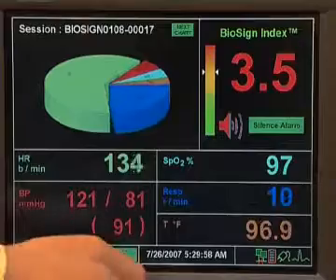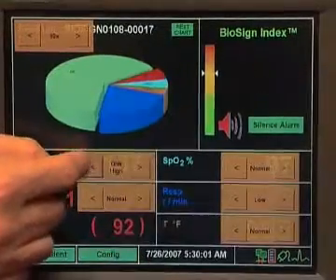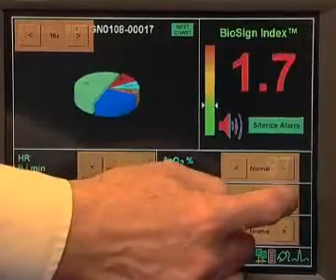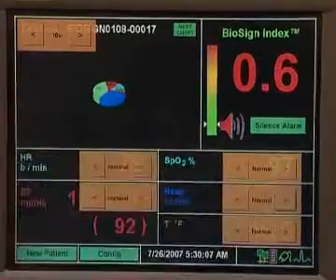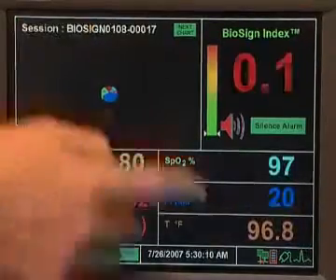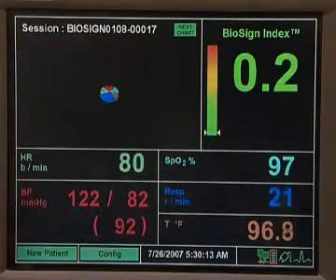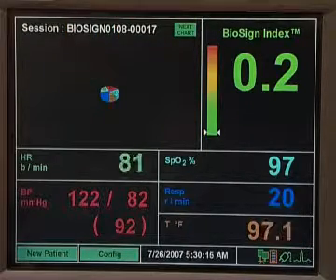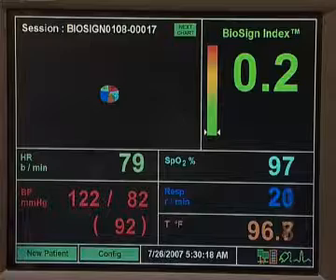Now let's imagine the patient recovers. I will restore these parameters to their normal values, and likewise for the respiratory rate. You will see that the number indicating abnormality goes right down — we're back in the green, the radius has been reduced, and the patient has fully recovered.